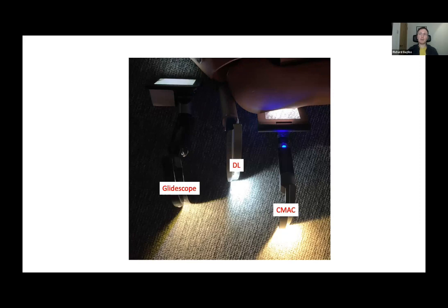One of the things from an organisational perspective is that you do need to train with these devices. You can't give these devices straight to somebody who's experienced with direct laryngoscopy and expect them to perform as well with a videolaryngoscope as they will with a direct laryngoscope. The physical technique and the tube delivery are actually different, and probably one of the pitfalls is trying to use them just like a direct laryngoscope. You often get a description that somebody has an excellent view of the glottis, but then they've been unable to pass the tube because they just can't get around the corner.